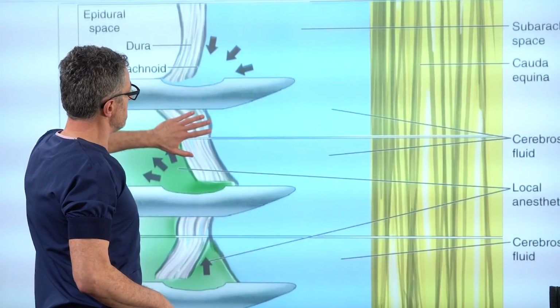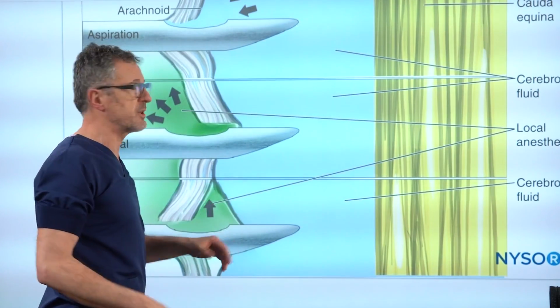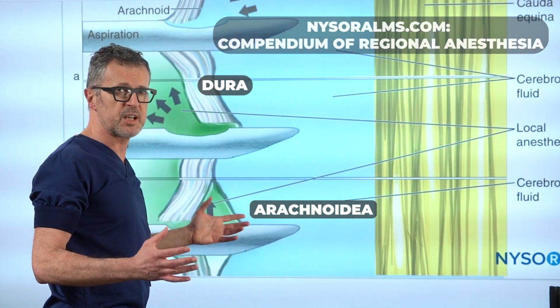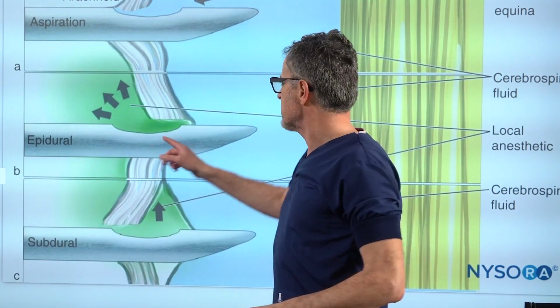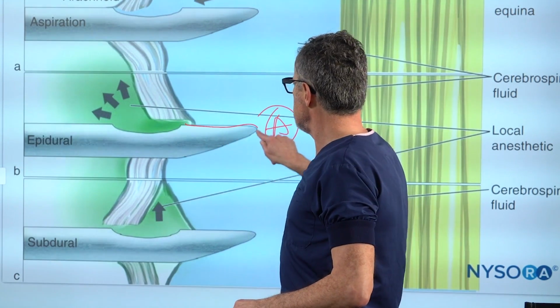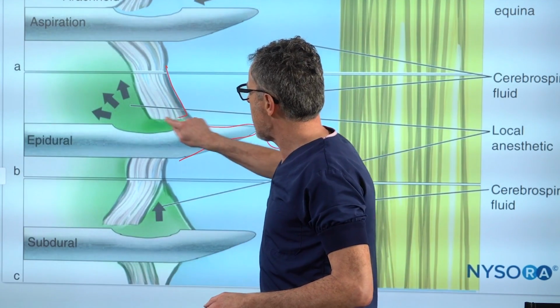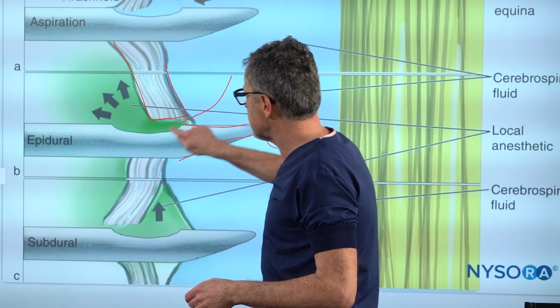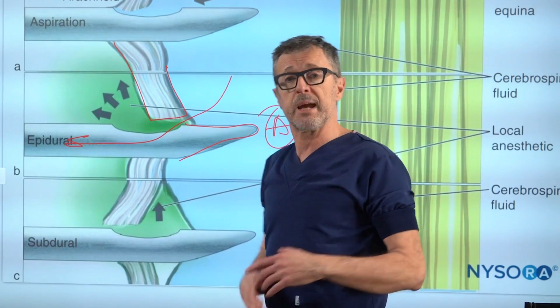Sometimes the needle does not make its way entirely into the intrathecal space. And sometimes you can get dural and subarachnoidal flaps that prevent successful spinal anesthesia. Let's talk about that. So here we have a situation in example A where the needle tip is introduced into the intrathecal space. However, there is a dural flap that obstructs the needle partially. It's quite clear that you can get the CSF outside of the needle. However, you may not be able to aspirate it.